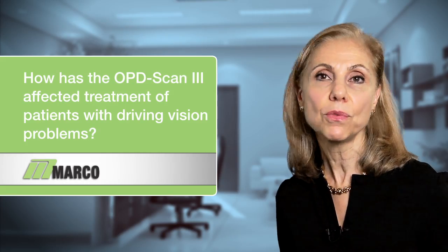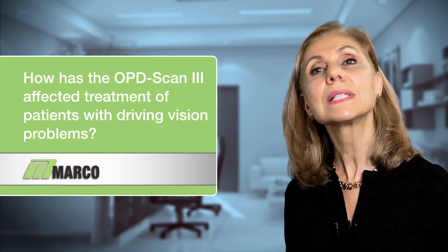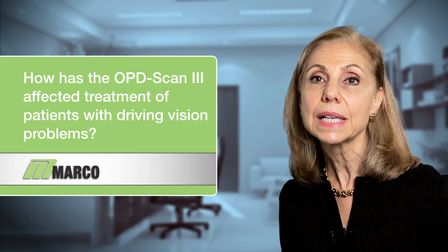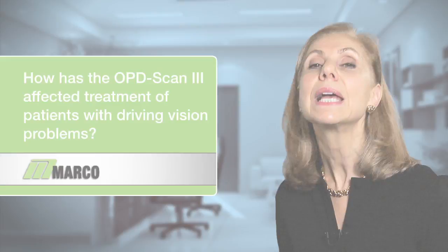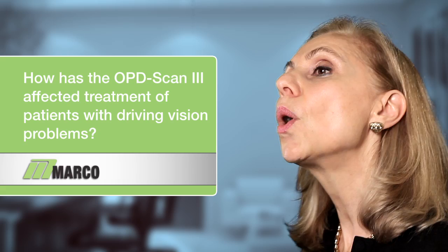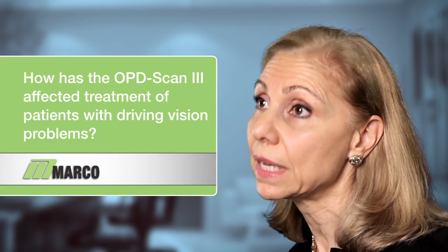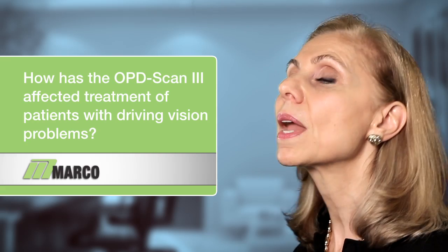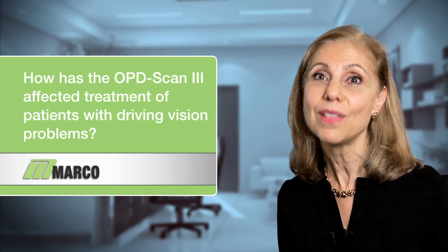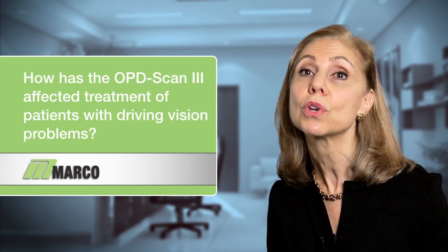Had it not been for the OPD III, we would not have been able to pick this up, because in our refracting lanes and exam rooms, we always have the same amount of light. And under that light condition, we were not able to mimic daytime and nighttime driving conditions. So with this feature in the OPD III, I think we'll be able to help with the frustration that these people have by finding a solution for their refractive issues.